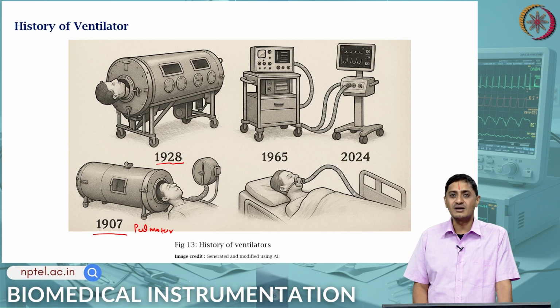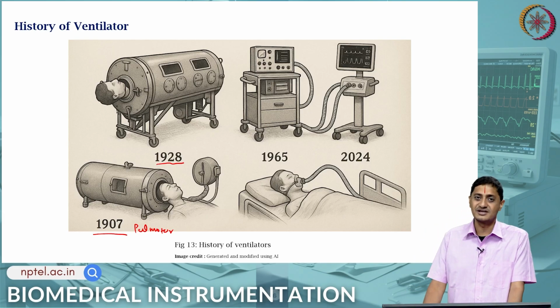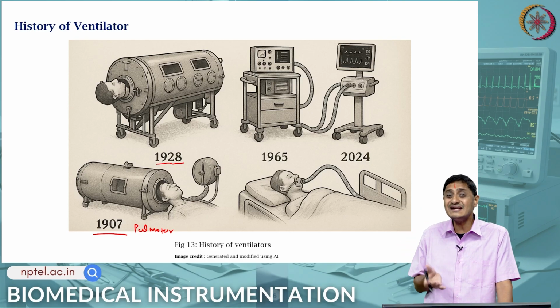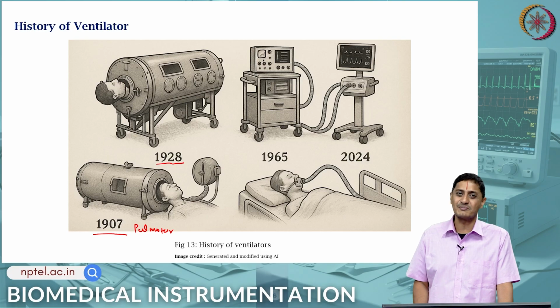It is essentially a complete jail for the patient. The patient will be alive, but they can do nothing else in life. So, that is the disadvantage. But the advantage is that it does not force air into the system, but creates a negative pressure such that air naturally flows in. That is how breathing itself happens. Breathing is natural, it is not forced.